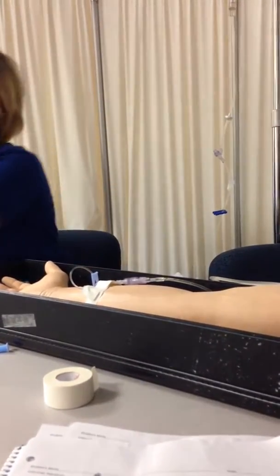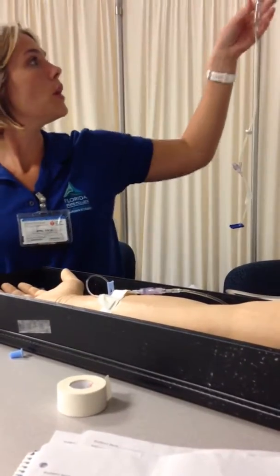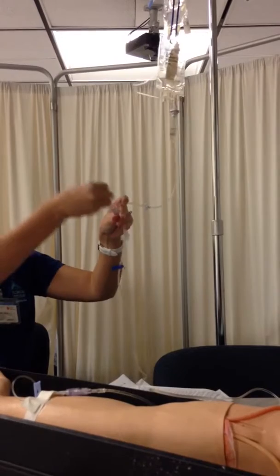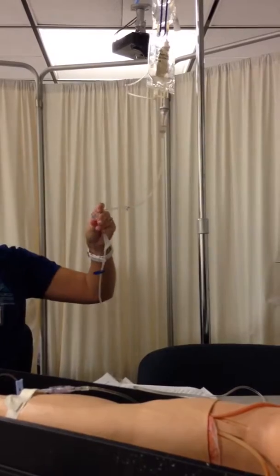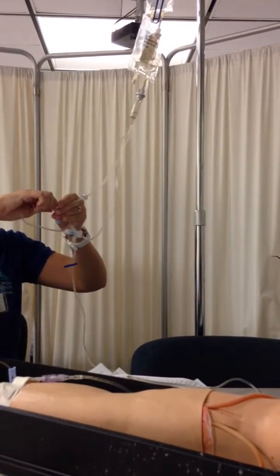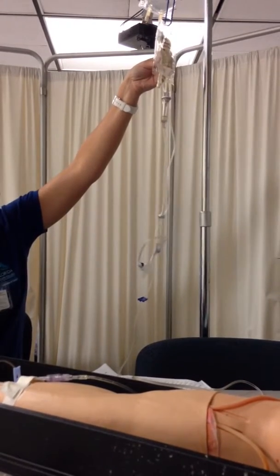Okay, I'm going to wash my hands and put my gloves on. All right, I look at my IV, everything is good. Now, the piggyback bag always needs to be higher than the primary bag. The site that I'm going to hook it on, I'll go ahead and clean that off. This is sterile, so now it's clean, everything's good. And what I will need to do now is set my rate for my medication. Pull it down, I'm going to set it right.